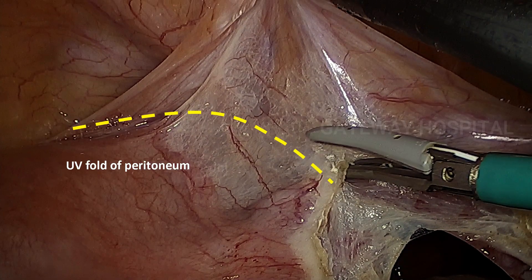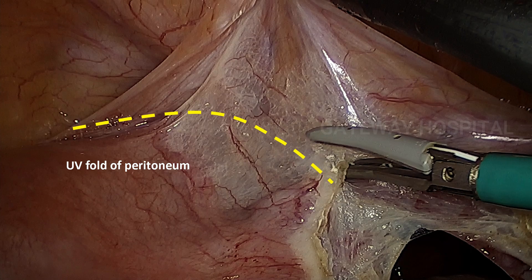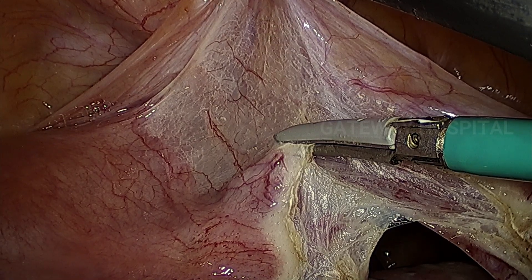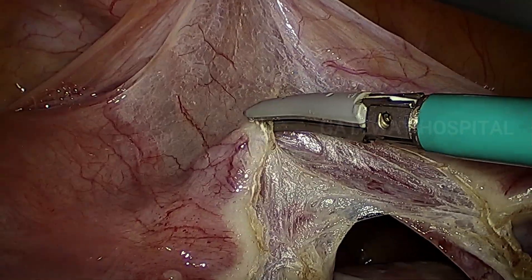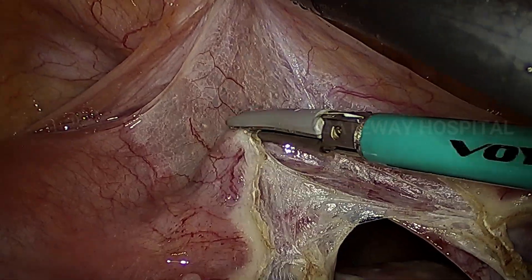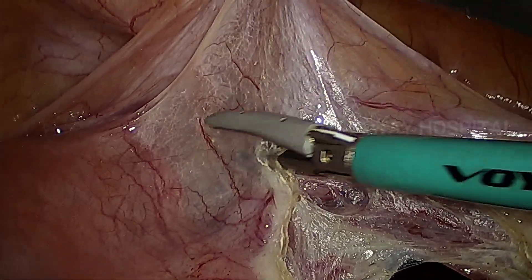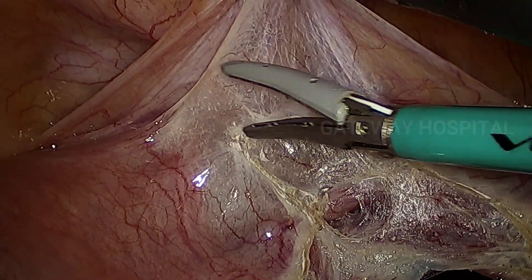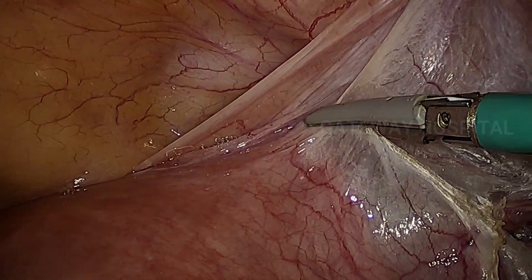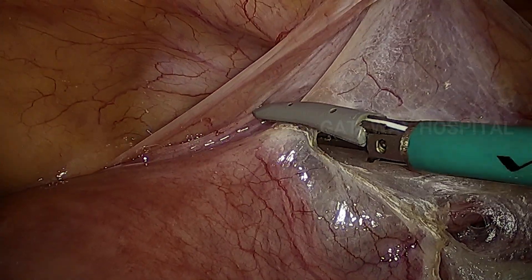You can appreciate the UV fold of peritoneum, which is being stretched by lifting the bladder using the left hand. Once you open the UV fold of peritoneum, the carbon dioxide will enter into the plane and it will open up the plane very nicely.